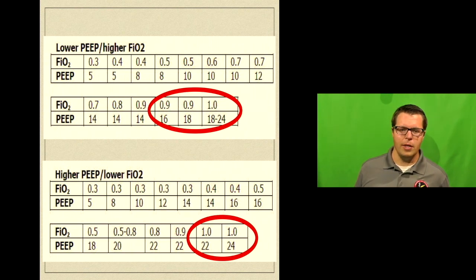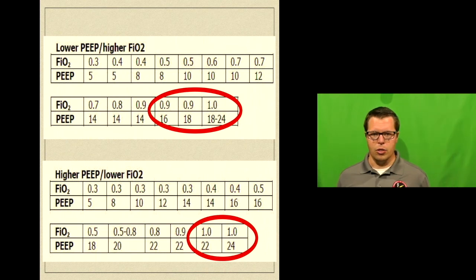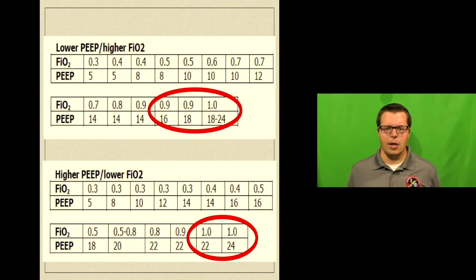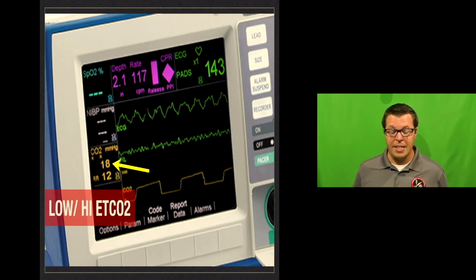Put 15 of PEEP on the guy and suddenly he oxygenates perfectly, and you can back him back down to 60% maybe. So use PEEP. Don't be scared of it. You're not going to hurt him if you're cautious otherwise, but you're not going to hurt him with PEEP basically. That's oxygenation and a good strategy for it.